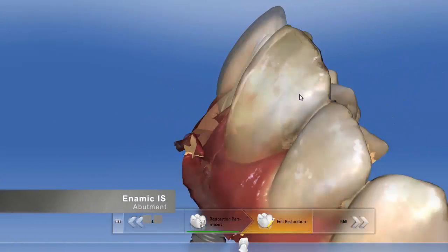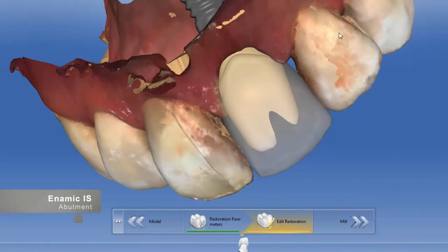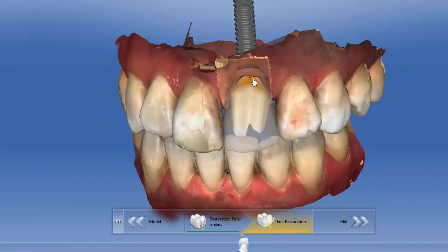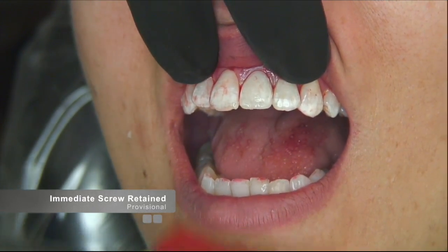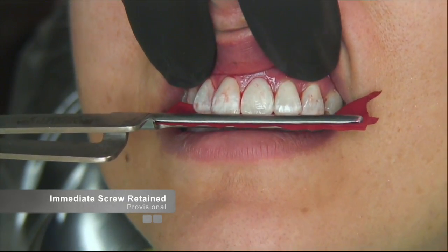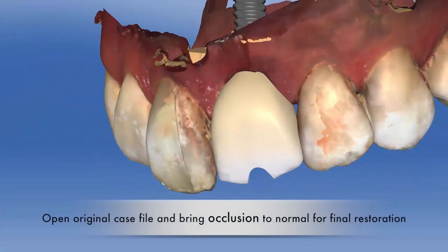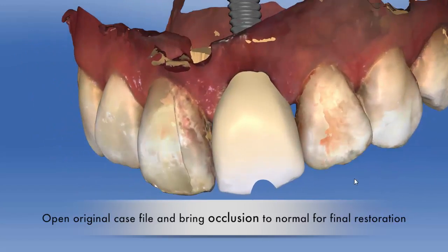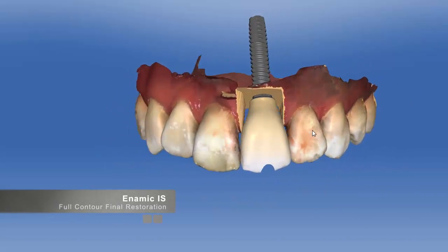Once the implant position is scanned, the user has the option to fabricate both screw-retained restorations as well as the abutment for a cement-retained restoration. If the clinician wanted to mill an immediate screw-retained provisional for a patient, the advantage of using Enamic is that when the patient returns for the final restoration, you can already have the case completed by simply opening the case file and milling another Enamic block. The final restoration can be completed before the patient comes back, thereby saving valuable time for both the doctor and the patient.